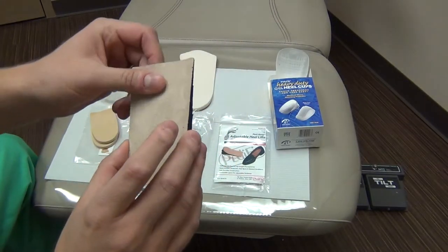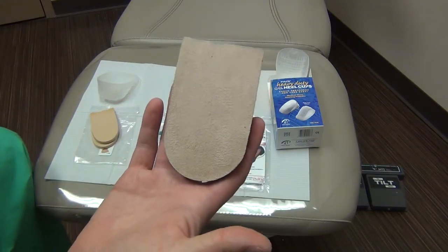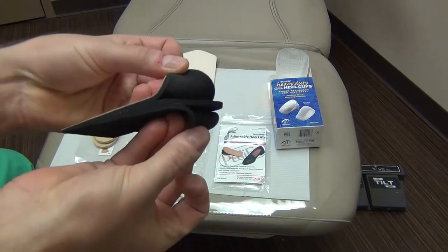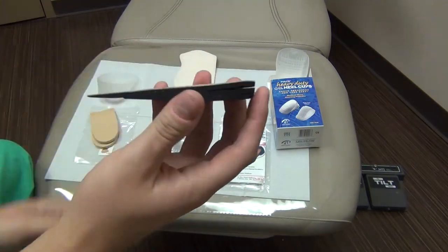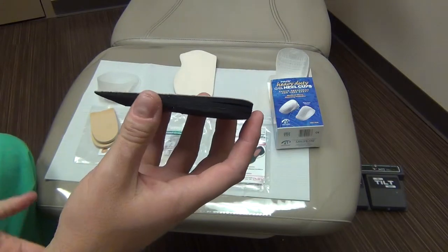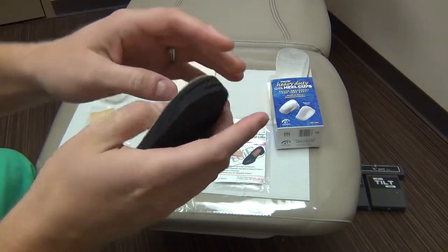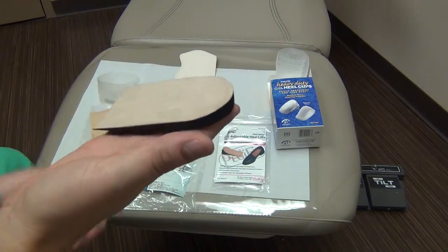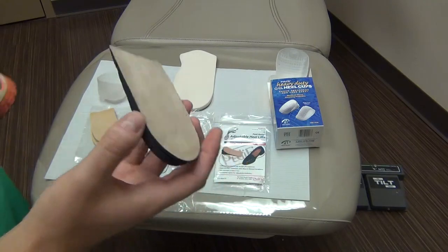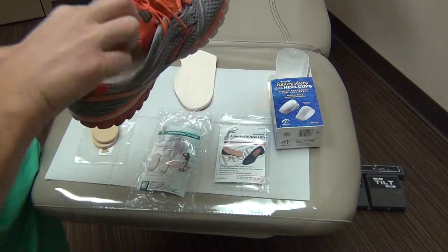One of the more common ones that we'll dispense — not so much for heel pain in the bottom of the foot but for the back of the heel — is these adjustable heel lifts. You can see they have several layers on them. These layers allow you to put them in the shoe and actually remove a layer if the patient's foot feels like it's popping out of the shoe. In some cases, we'll instruct patients to remove a layer every several weeks so they can slowly ease their heel back down to the floor. It does a great job of lifting the heel, and by doing so, it takes tension off the Achilles tendon, which can become very uncomfortable.